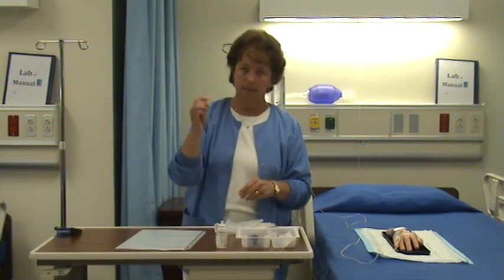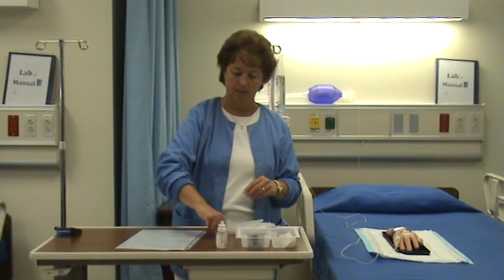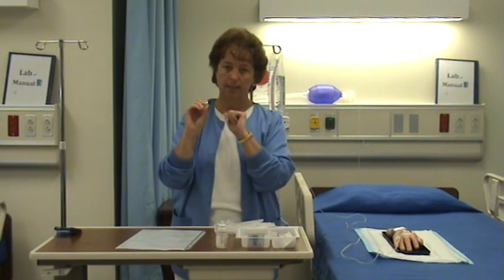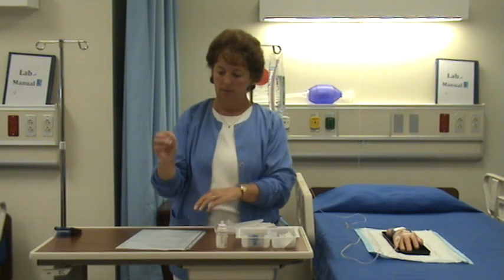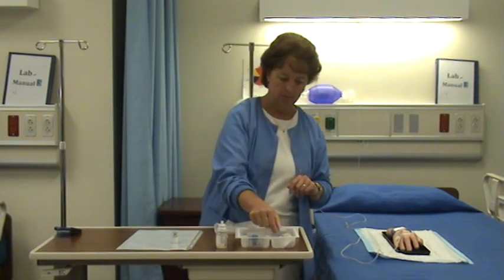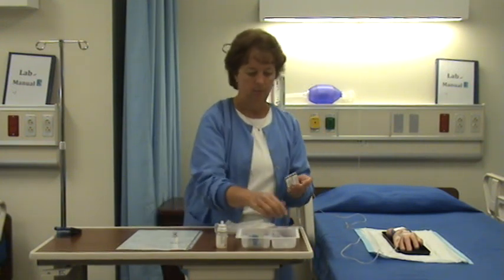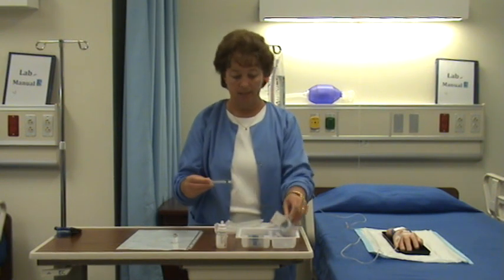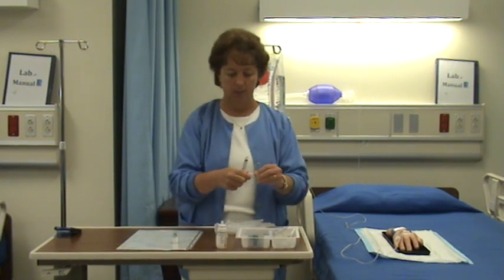I'm going to open this vial up to show you the top of it. Because this is not accessed with a blunt cannula, I need a needle to withdraw that fluid. So I'm going to get a 3 cc syringe and place a needle on the end of that so that I can withdraw the medication.